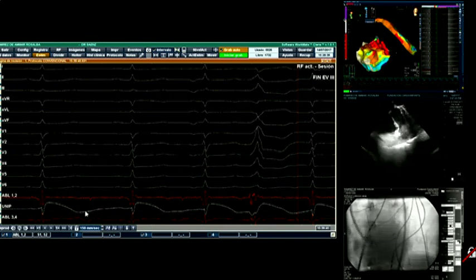It appears to be a good question. I usually have an aversion to placing catheters in the neck because there is a higher incidence of hematomas and neck problems, which I believe are unnecessary. But I understand what you're saying, and it is true. Going into the coronary sinus from the neck is easier.